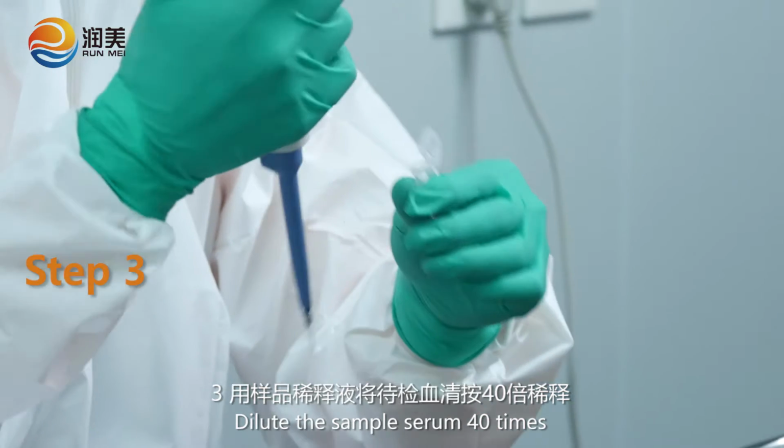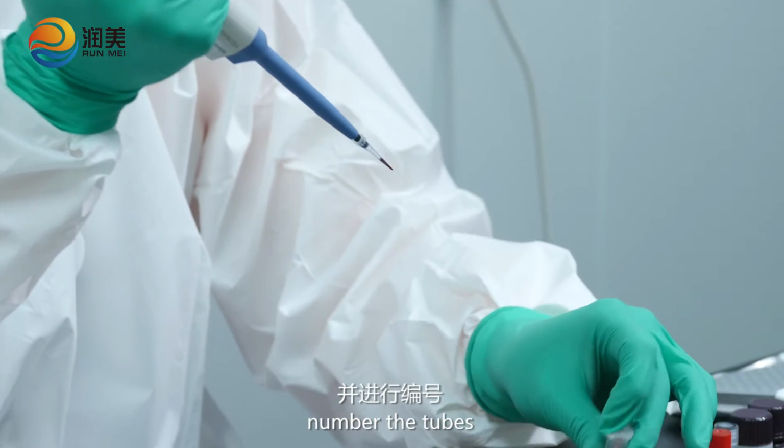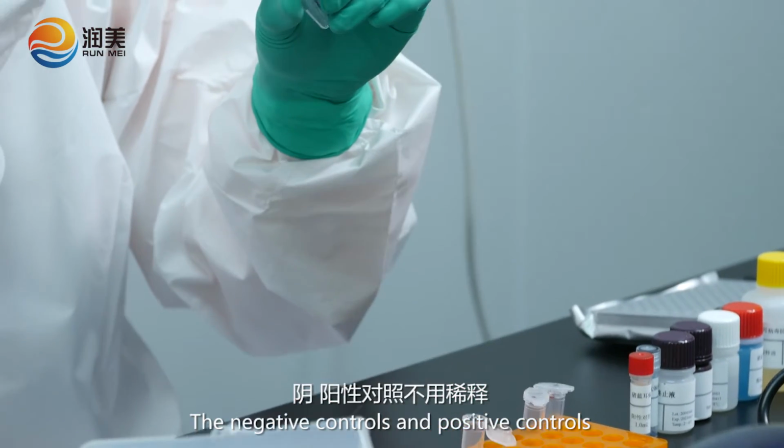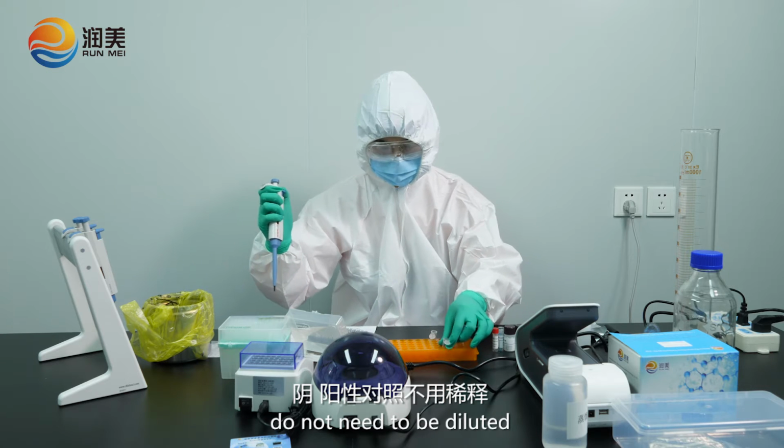Dilute the sample serum 40 times with sample diluent. Number the tubes. The negative controls and positive controls do not need to be diluted.